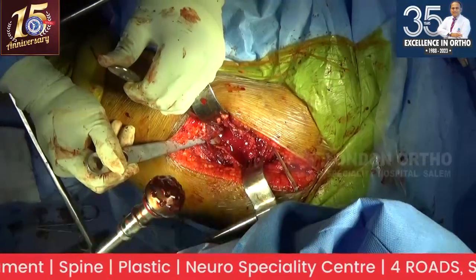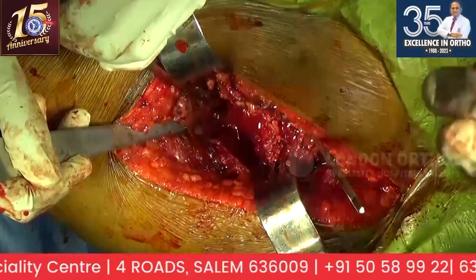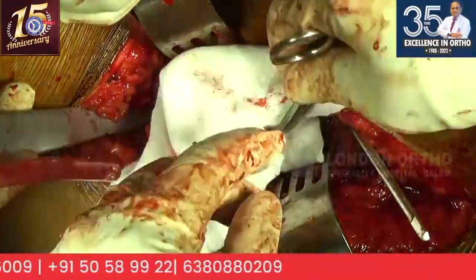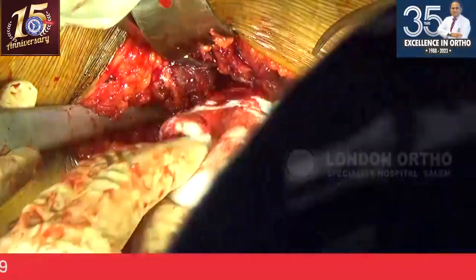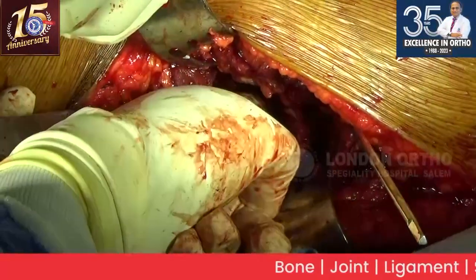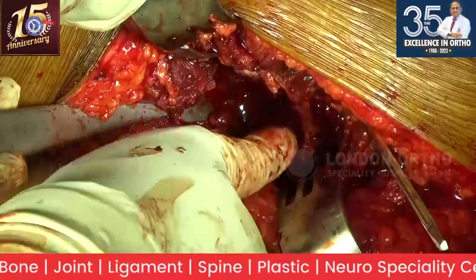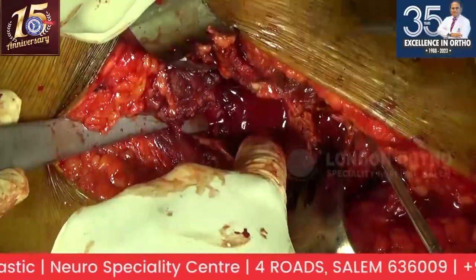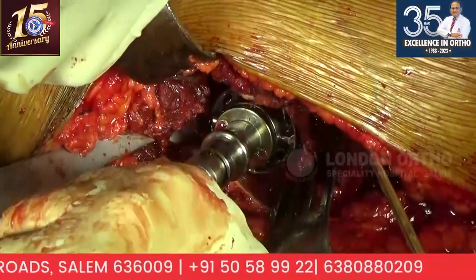Yeah. So you want to bias the reamer a little posteriorly. You feel that the posterior bone is a little better, because I could see that you are pushing the reamer a little on the posterior aspect. Yeah, that's what I'm checking now. The medial wall is very thin, almost crackling, there's a little hole there. When we are doing an anterolateral approach, there is always a tendency to ream more anterior. So I always make sure that you push it a little bit posterior. Yeah, I want to make sure it is not going anterior.